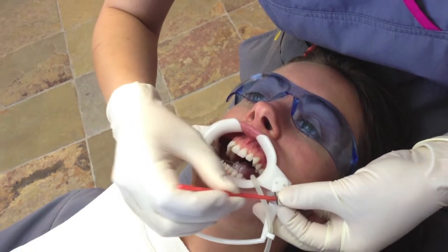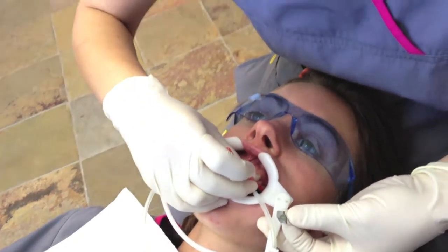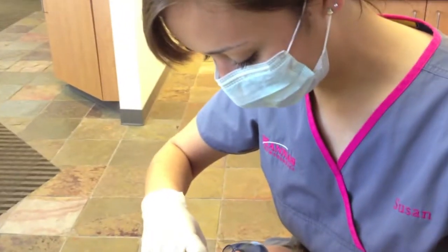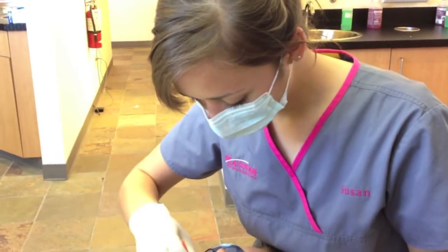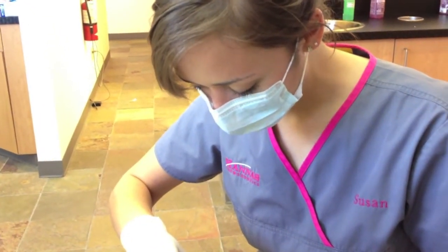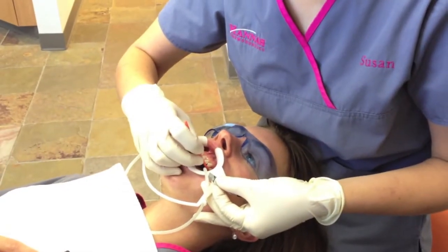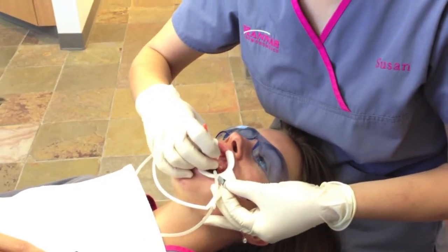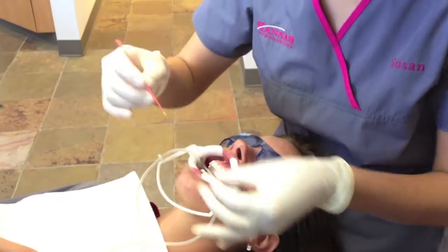The longest part of the braces is mostly just laying down with your mouth open while we clean up the teeth. It usually doesn't hurt at all to get the braces on. It's usually the day after and then for the next three to four, maybe five days. And then just every now and then as the teeth start moving.